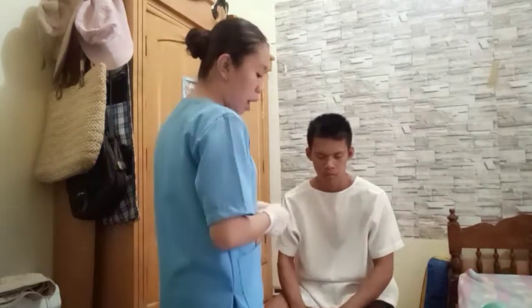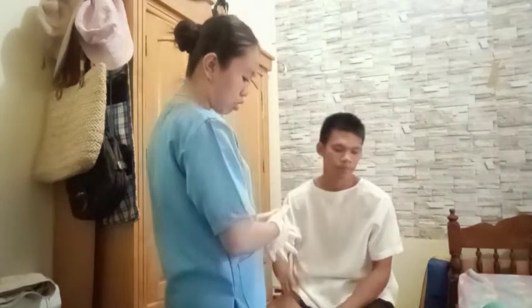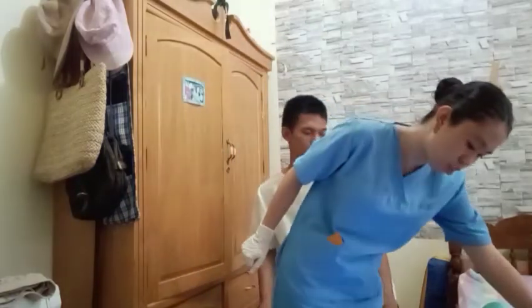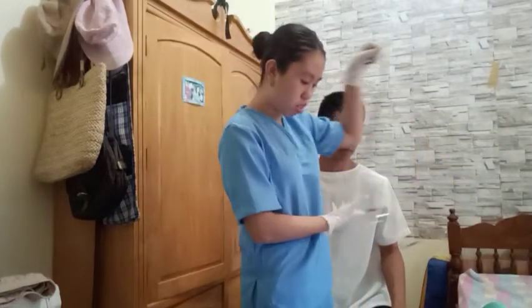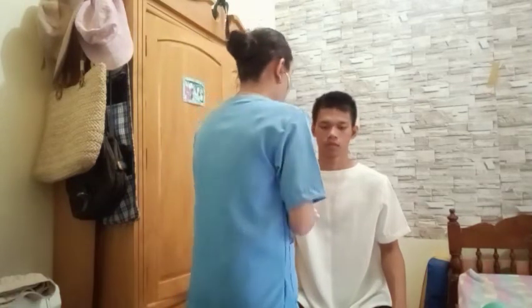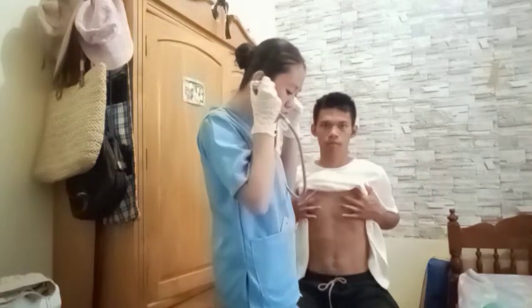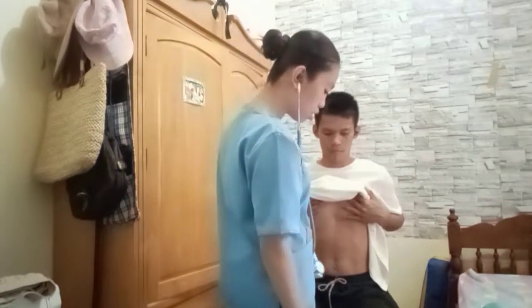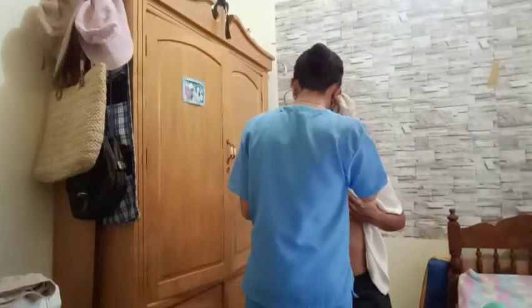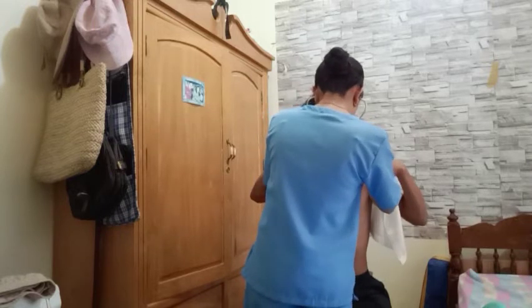Okay, so I will be auscultating for breath sounds, adventitious sounds, and the voice sounds. So, sir, I will be using this stethoscope, sir. Can you please whisper the words 1, 2, 3?